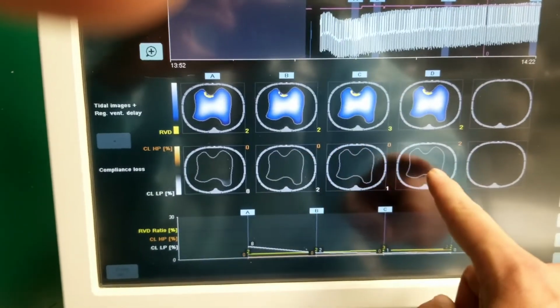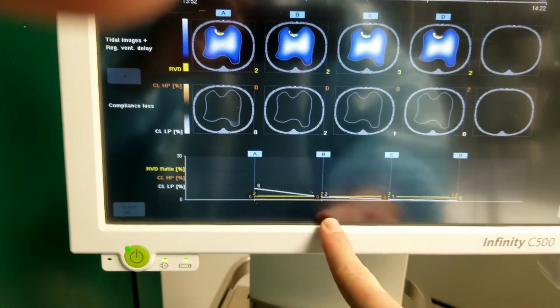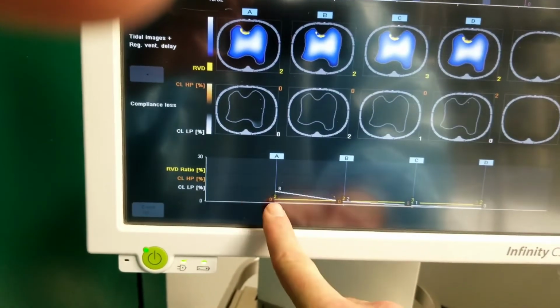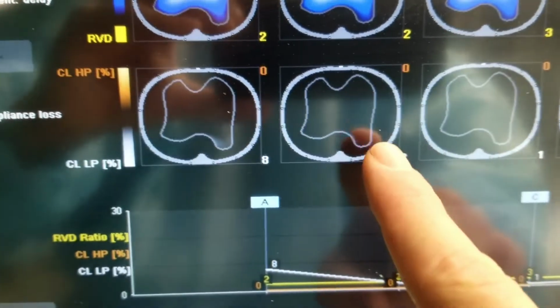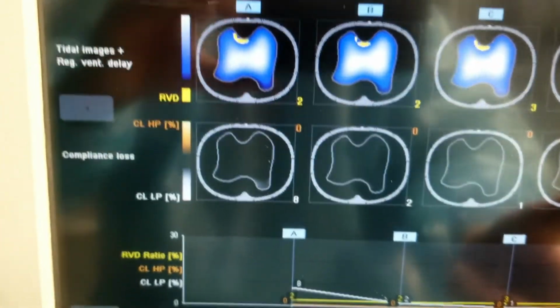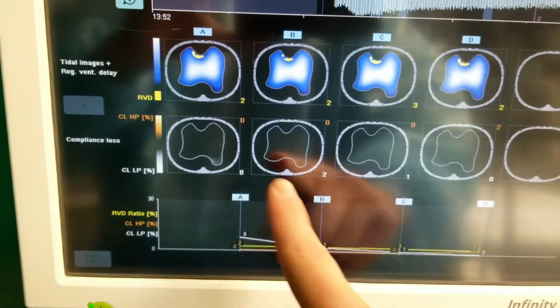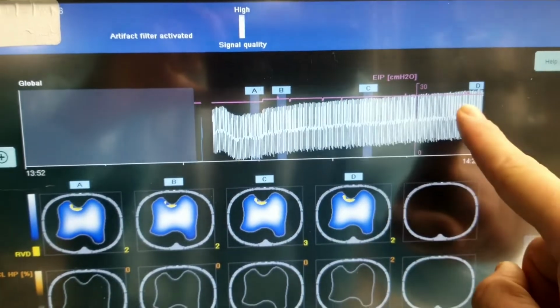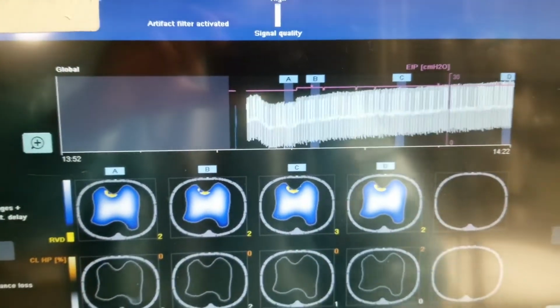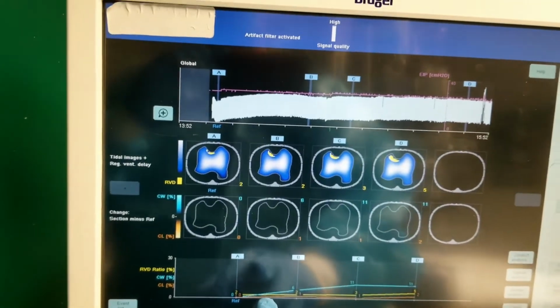White areas is atelectasis. So this was the jump from 24 to 25, and we see that there's a slight drop in this area that was causing an issue, and then it disappears the minute we go to 25. Zero orange here, no loss. So we're doing good. No loss in compliance everywhere, a little bit less de-recruitment, and recovering our functional residual capacity over time.